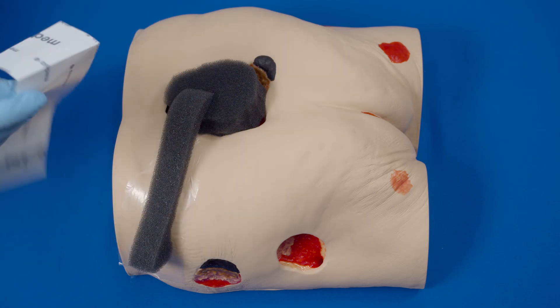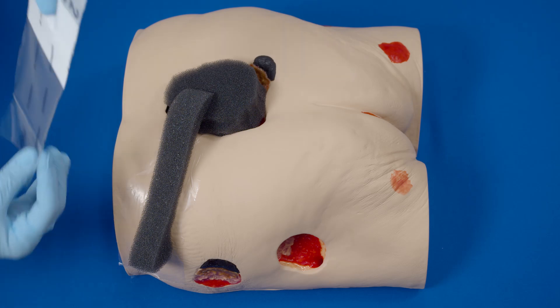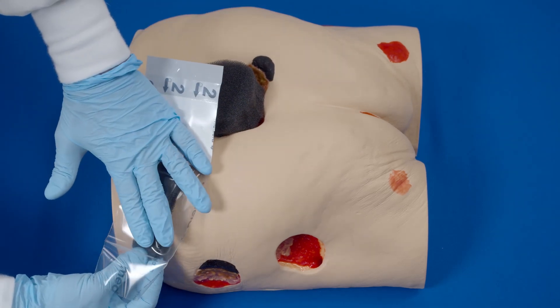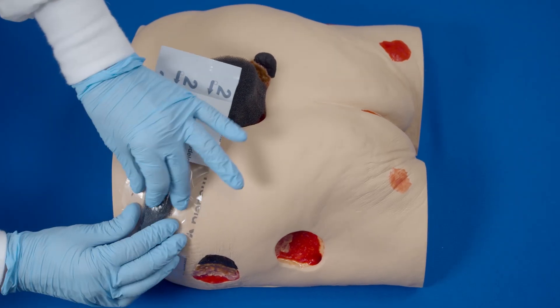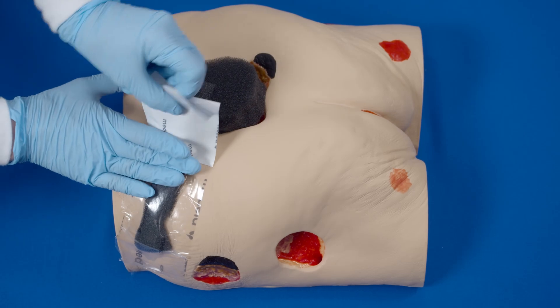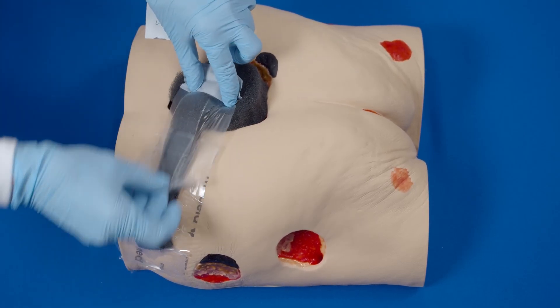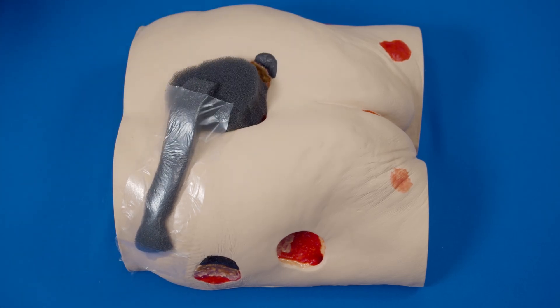Partially peel back one side of layer one and place adhesive side down, then remove the remaining side of layer one. Now remove the backing — layer two. Remove the perforated silver-colored tab on the side. The film should extend three to five centimeters beyond the margin of the foam dressing to facilitate an adequate seal.